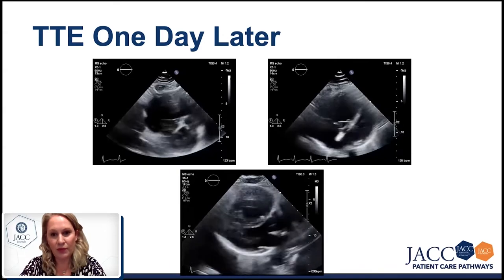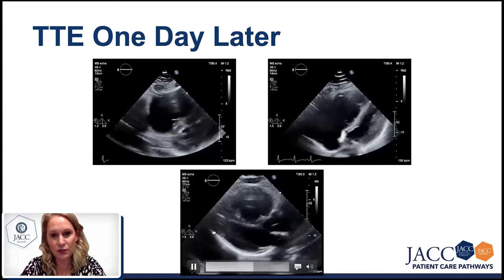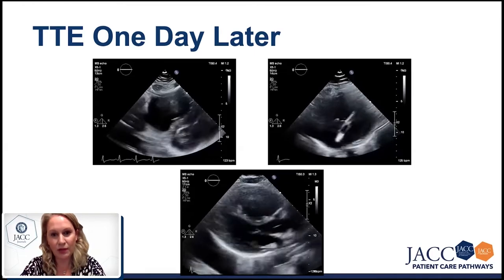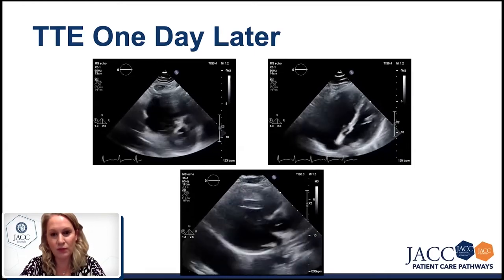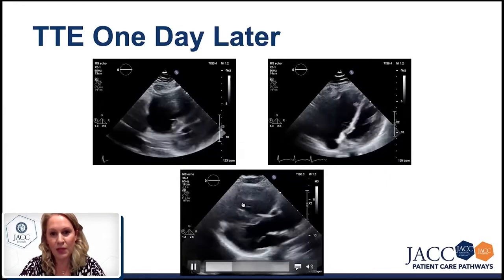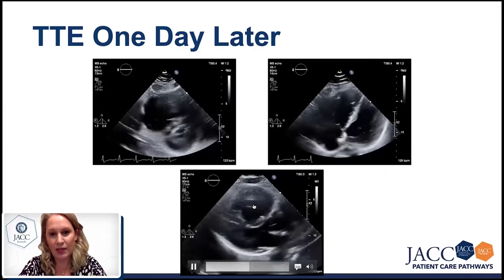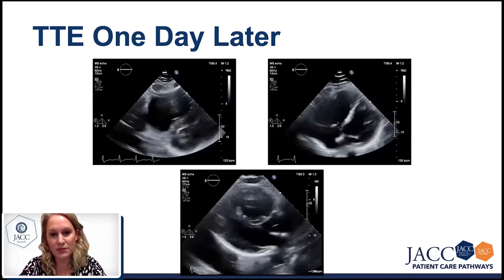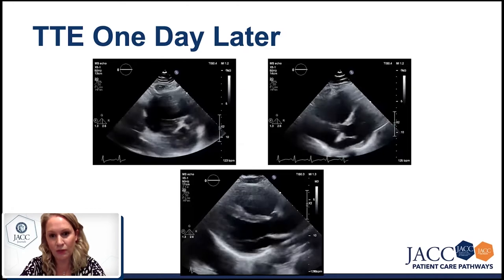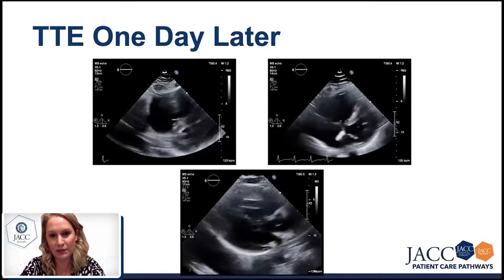At the bottom, we have the parasternal long axis view. The left heart is normal in shape and good in function. But at the upper part, we have the anterior portion of the RV, which is dilated and dysfunctional. So we have significant systolic dysfunction of the right heart and significant dilatation.